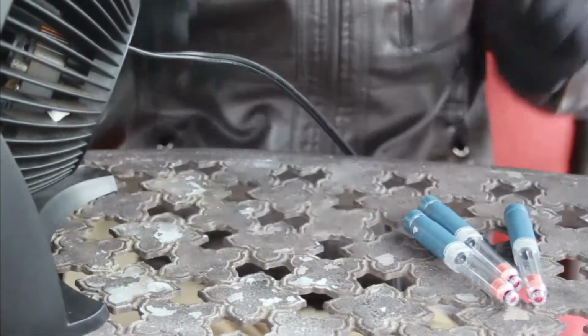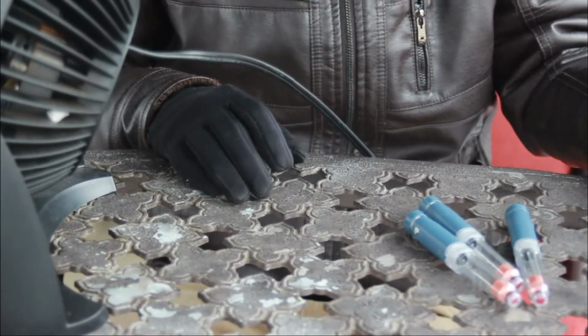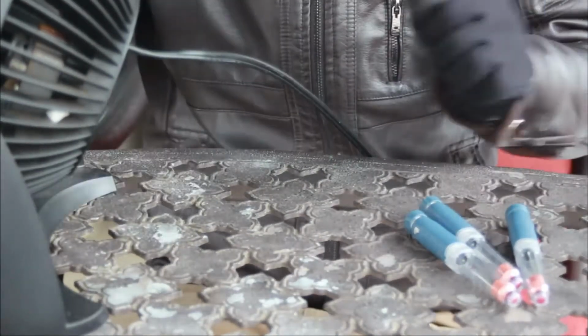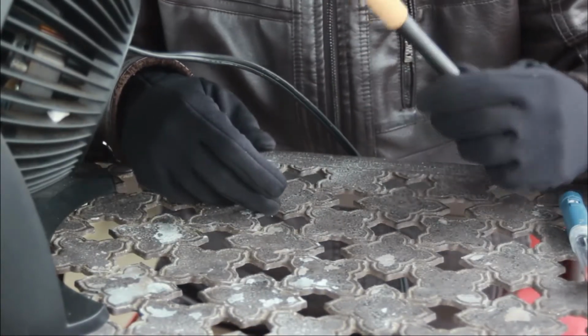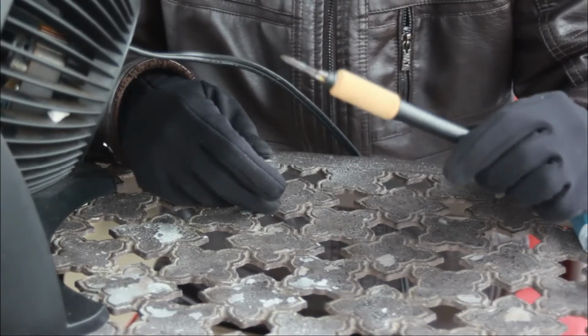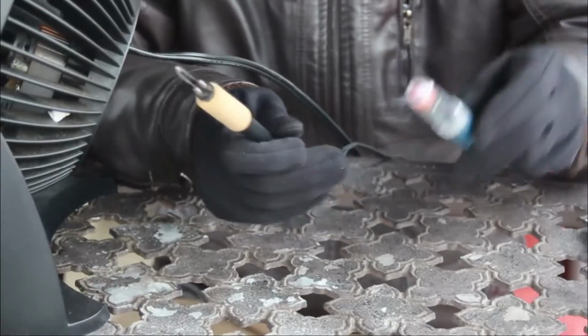Next step is going to be, of course, to actually burn it. We're going to let this heat up a little bit longer because it is cold out, but soon we'll be started here. Now you can't tell because it is cold out, so you really can't see the origins of it, but this hot knife has gotten pretty hot. So we're going to go ahead and start on this. We're going to start with this one right here.